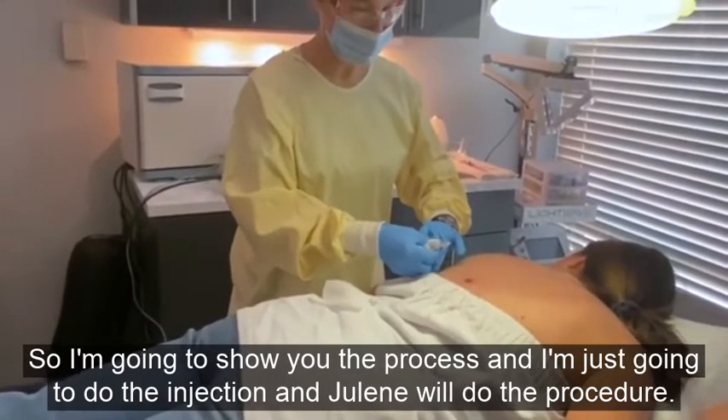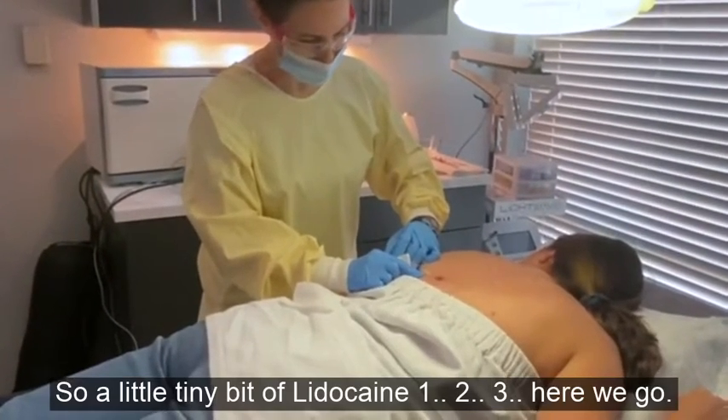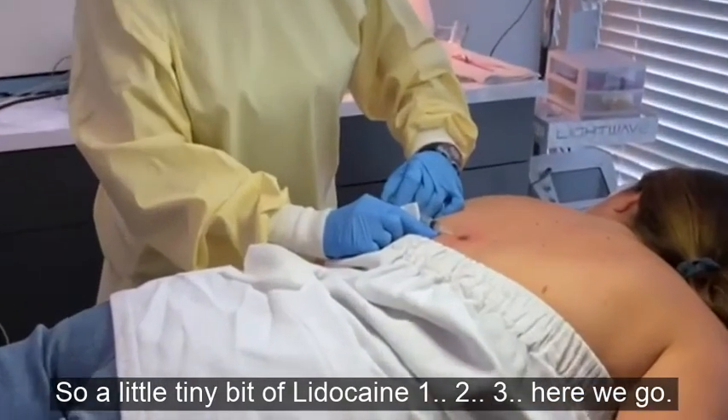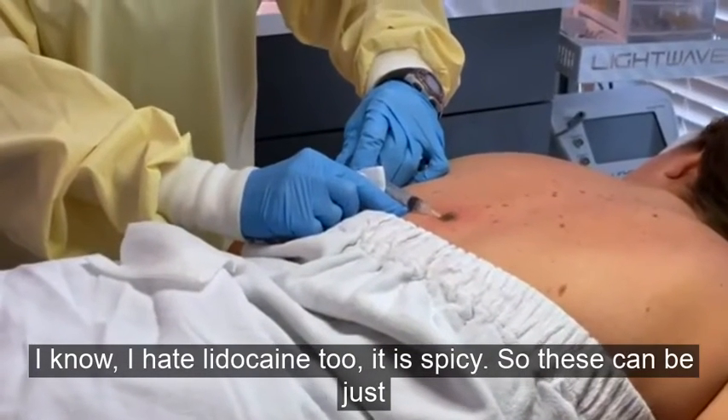I'm going to go ahead and inject — are you ready? Okay, just a tiny bit of lidocaine: one, two, three, here we go. I know, I hate lidocaine too — it is spicy.